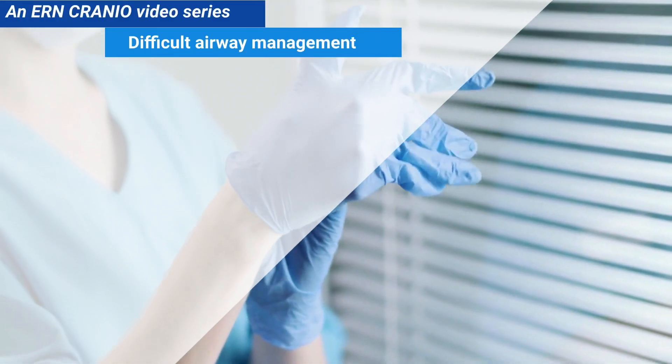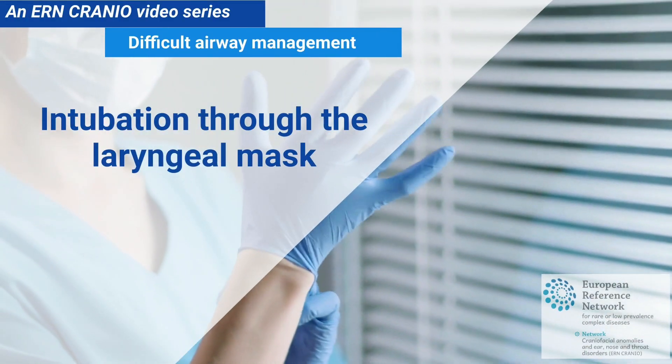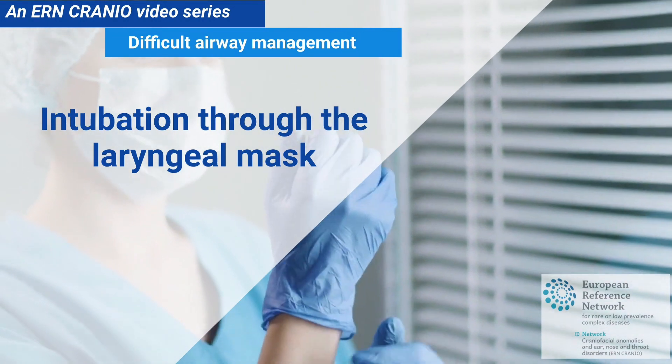This is a video series from the European Reference Network Cranio. Intubation through the laryngeal mask.